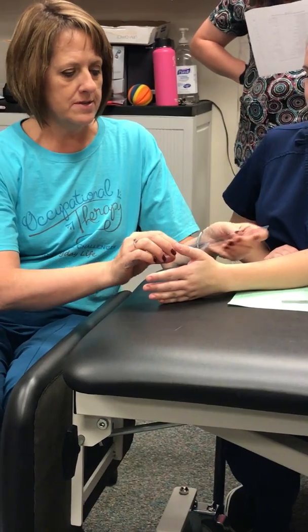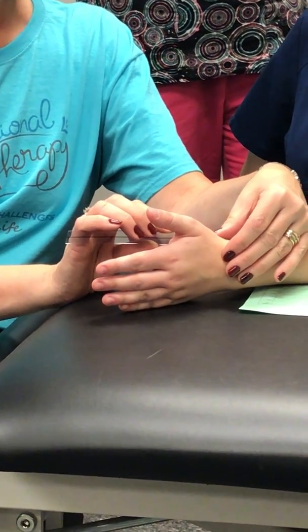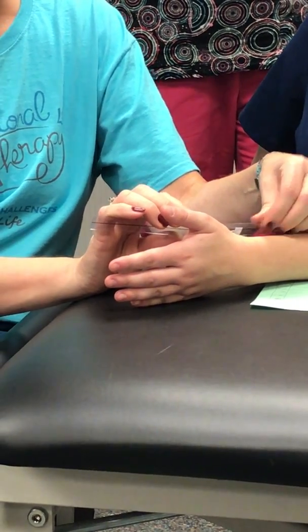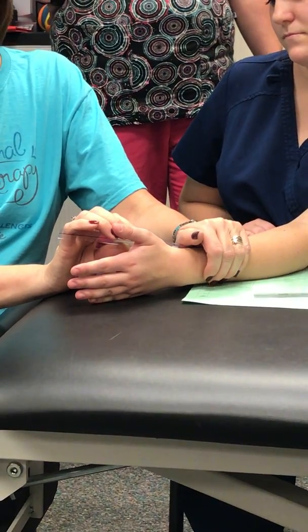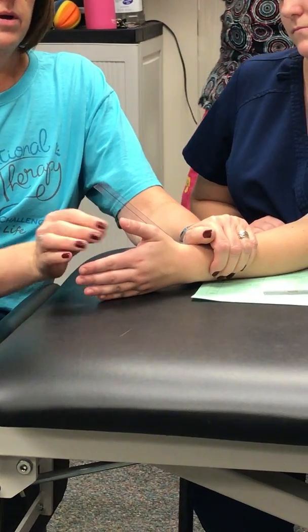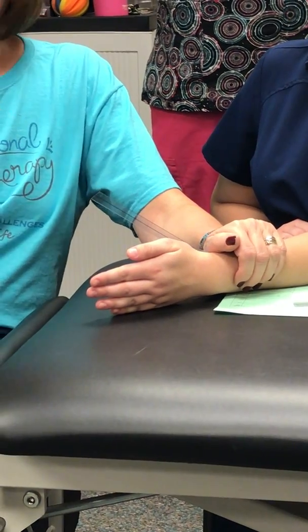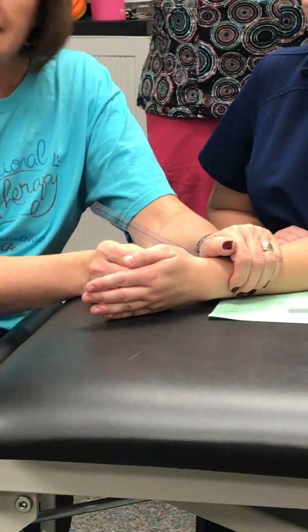I'm going to use the base of the metacarpal joint. I'll have the stationary arm following the radius, and then I'm going to line up my mobile arm with the metacarpal of the thumb.